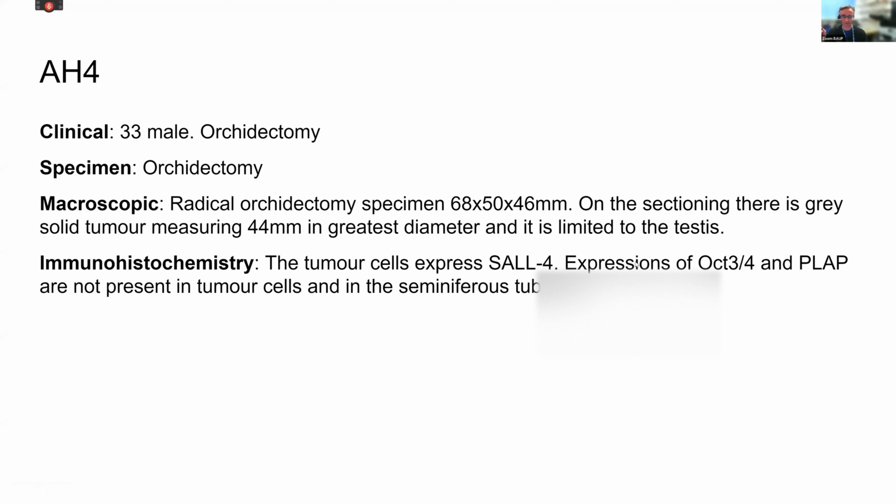Okay, all right. Again, first testicular case. 33-year-old male, that's quite important. So a middle-aged chap, a 44 millimeter grey looking tumor in the orchidectomy specimen. And we were given some markers. SALL4 was positive, OCT3/4 and PLAP negative.